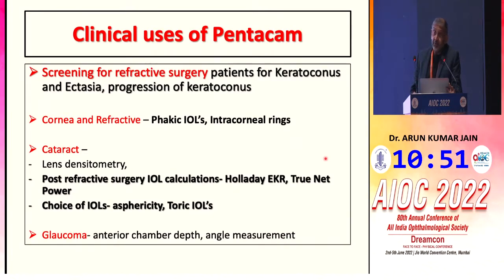These are the various conditions for which Pentacam is being used. Most common is screening for refractive surgery to rule out keratoconus or ectasia or progression of keratoconus, especially subclinical keratoconus.